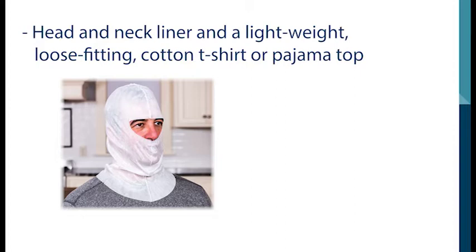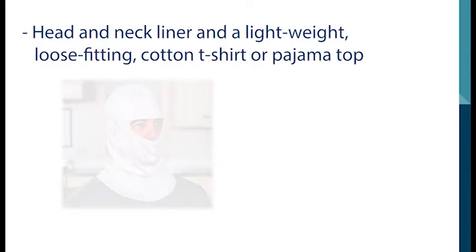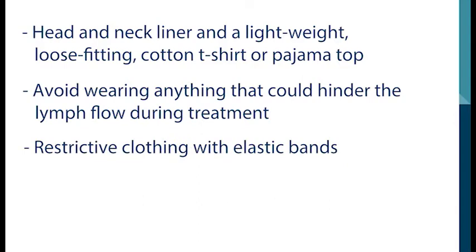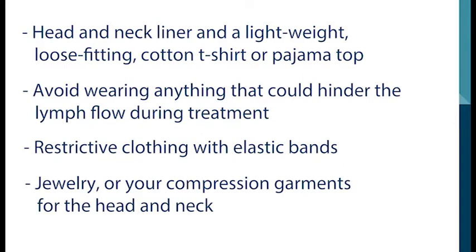For ease of viewing, our model will not be wearing a head and neck liner during the remainder of this video. Avoid wearing anything that could hinder the lymph flow during treatment. This includes items such as restrictive clothing with elastic bands, jewelry, and compression garments for the head and neck.